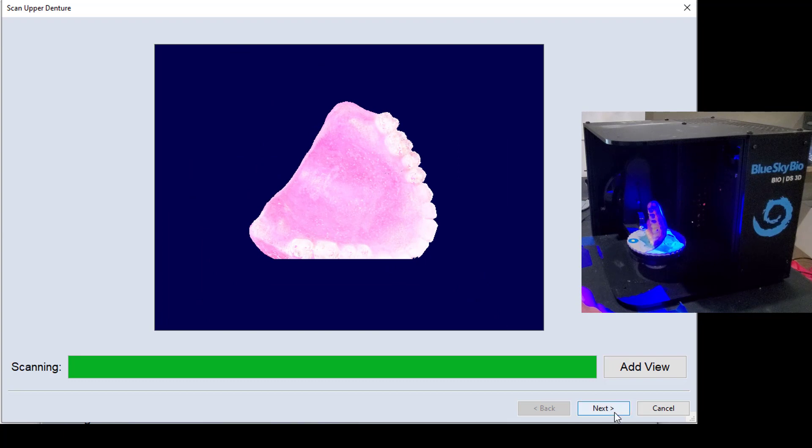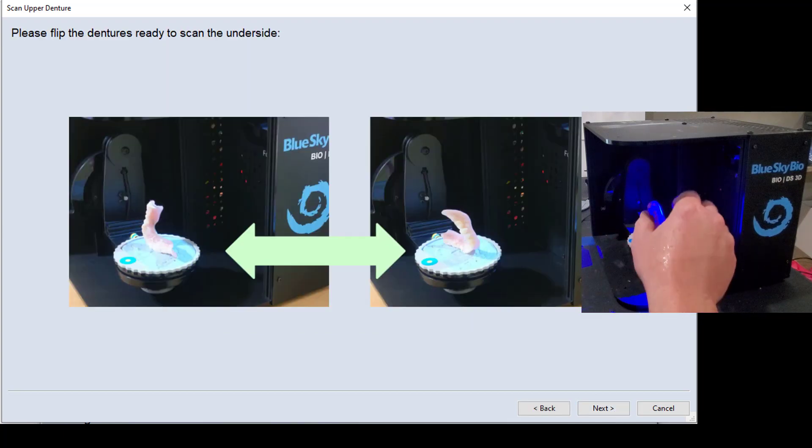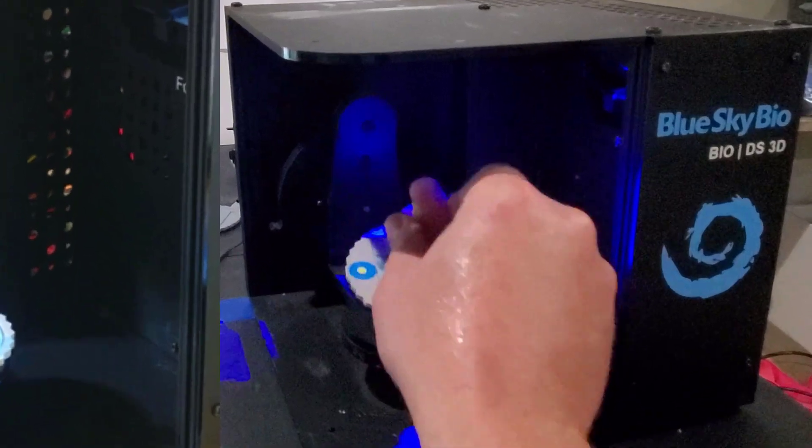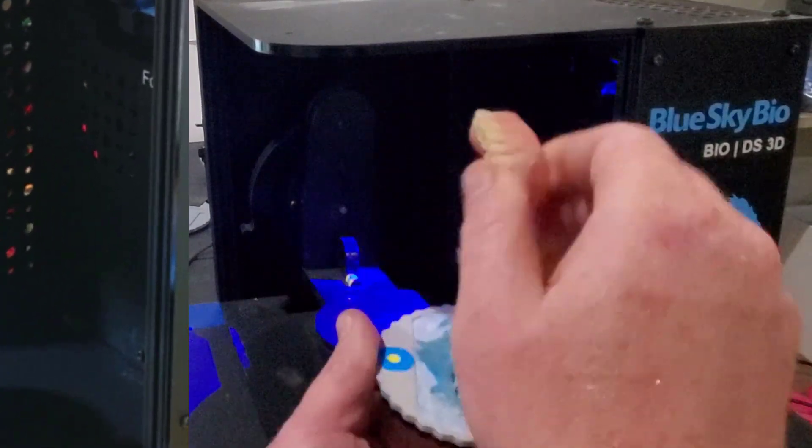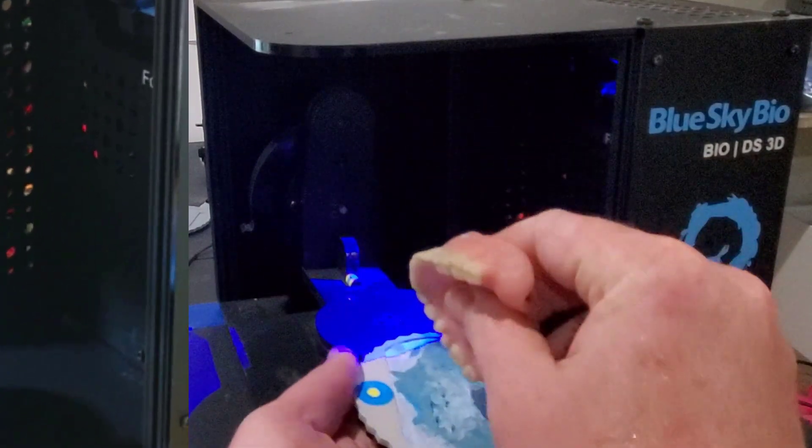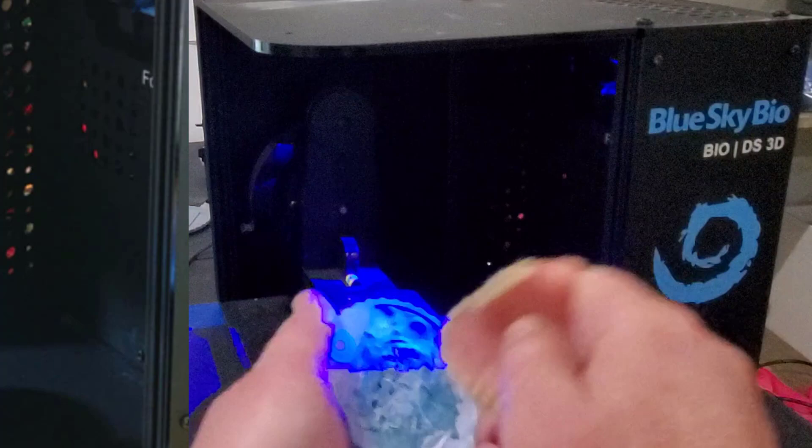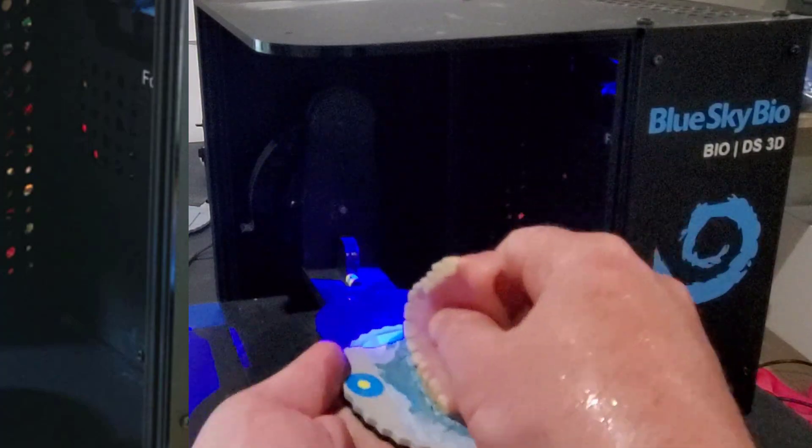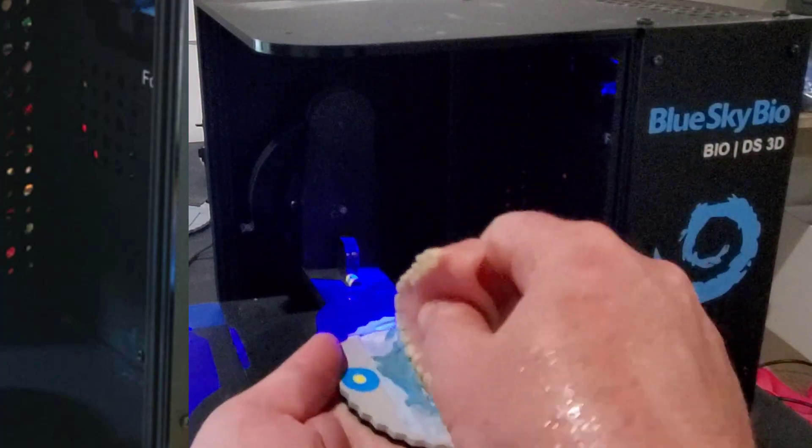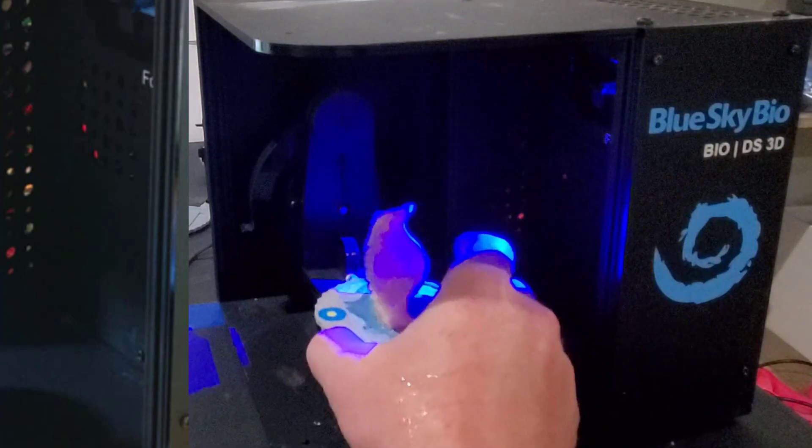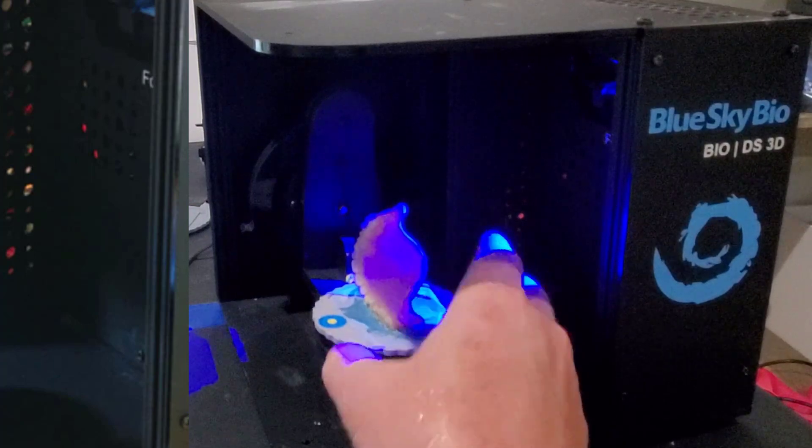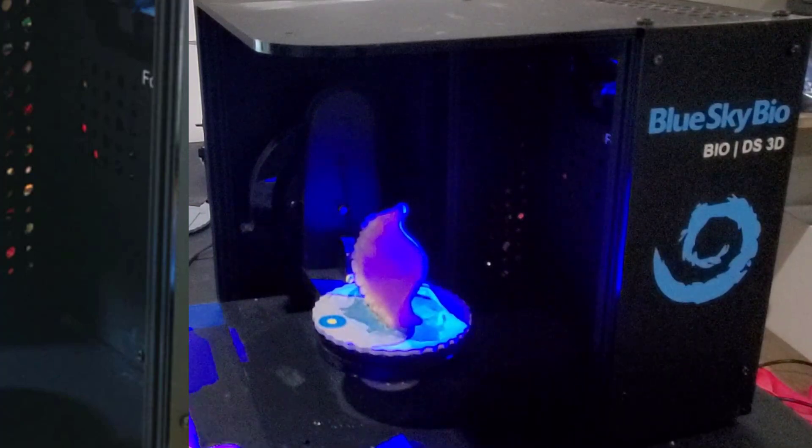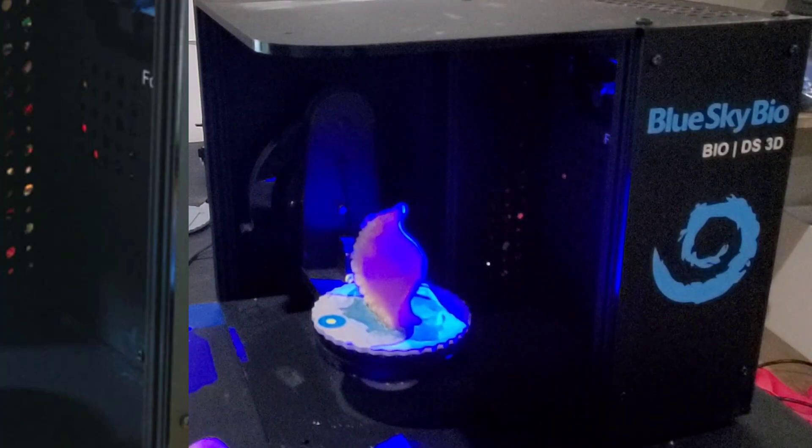Okay, so let's click next now. And the software is going to direct us to go ahead and flip this over. So once again, with the tissue side towards the camera, we're just going to take the denture, and this time embed it with the opposite side, the buccal side of the denture down on the tack, and then the tissue towards the camera.